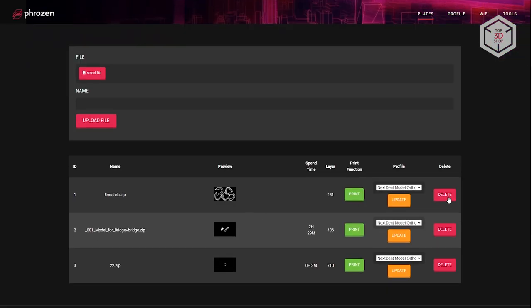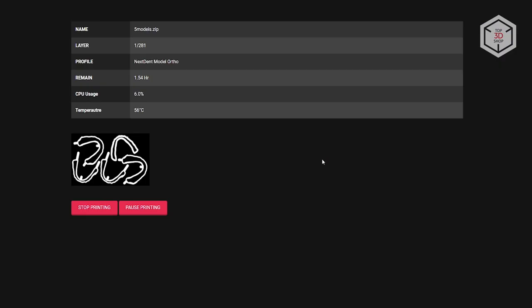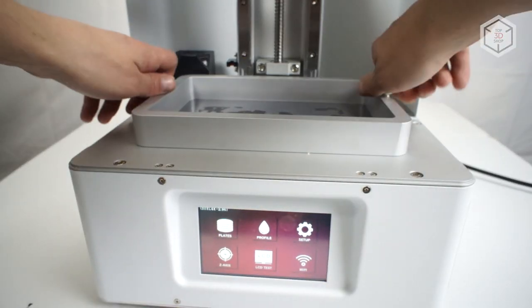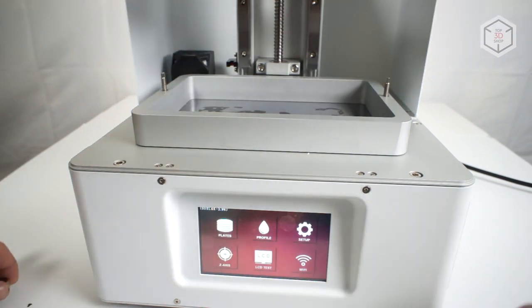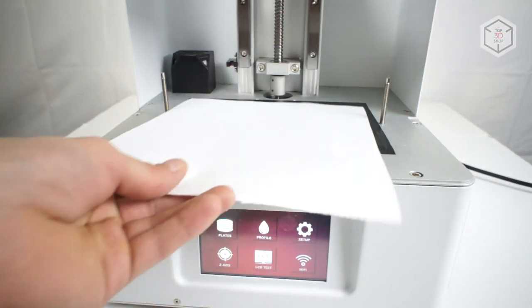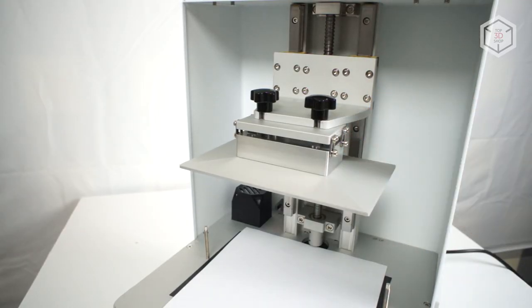However, the option of saving the sliced files to a USB flash drive and starting to print directly from the machine is still available. Let's move on to the test prints. First, it is necessary to calibrate the print bed. This is done in the same way as on any other resin 3D printer. Remove the vat and put a sheet of paper on the screen. Loosen the four screws on the platform so that it can move freely.